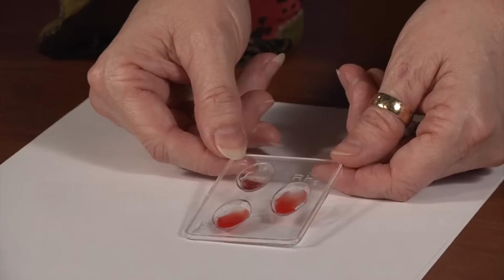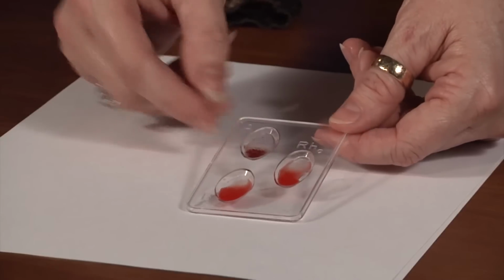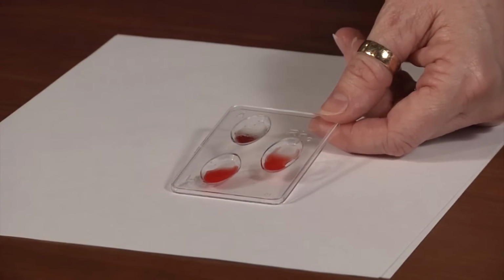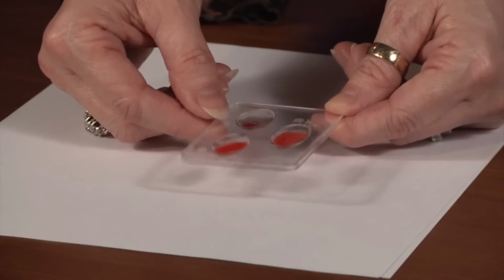After a few seconds, you're going to be looking for the reaction known as agglutination. Now, this is not blood clotting. Blood clotting involves clotting factors. We are looking for agglutination, which happens when antibodies bind to the antigens on the cell surfaces. So you're going to see a clumping together of the cells. Now, you can see very clearly in the well marked A, all of the erythrocytes are bound together because we have bound those antigens and antibodies together. So there we see a positive agglutination reaction.